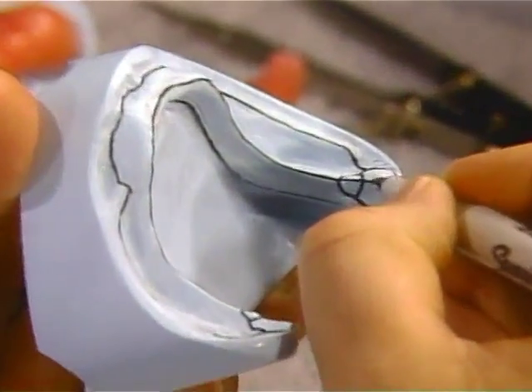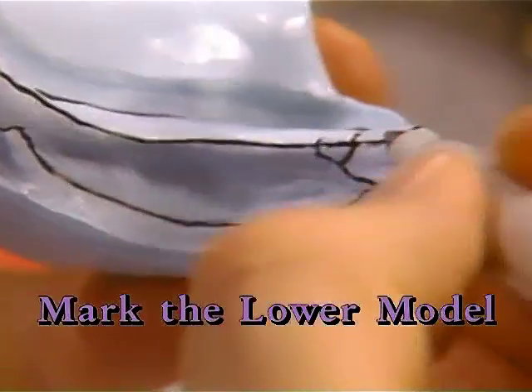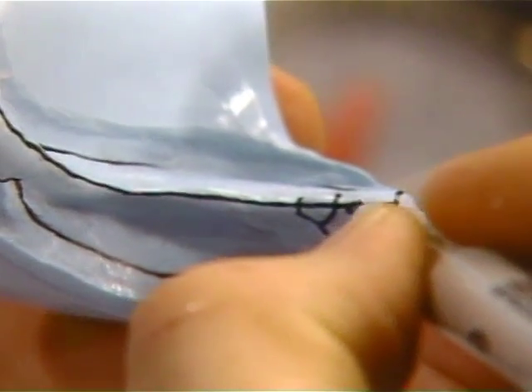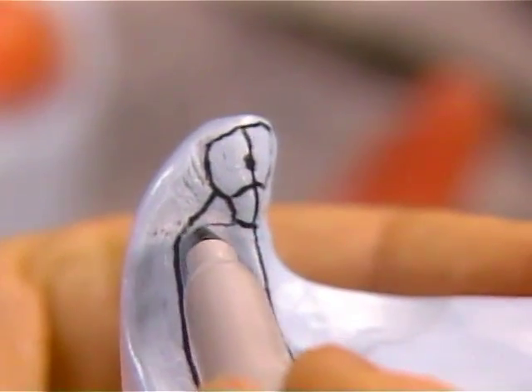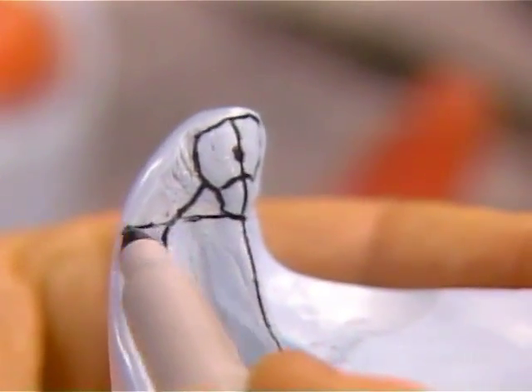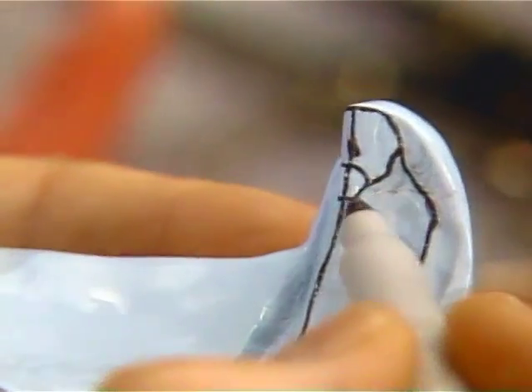Turn to the lower cast. Outline the retromolar pads. Place a dot in the center of each pad. Draw a horizontal line on the cast at the bottom of each retromolar pad. These lines must be visible with the lower base on the cast.